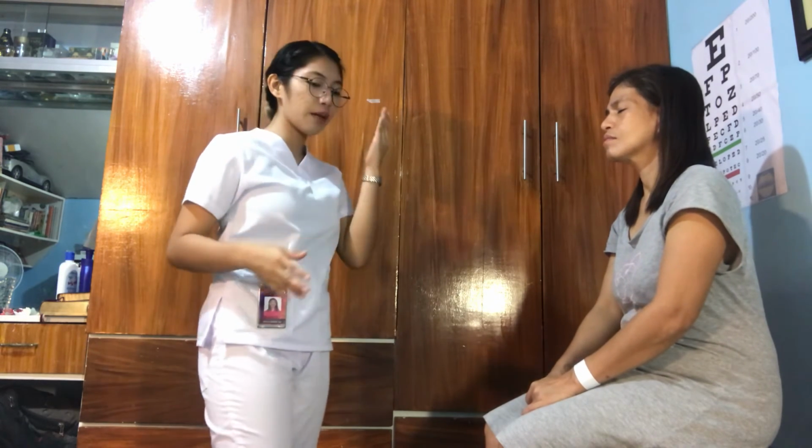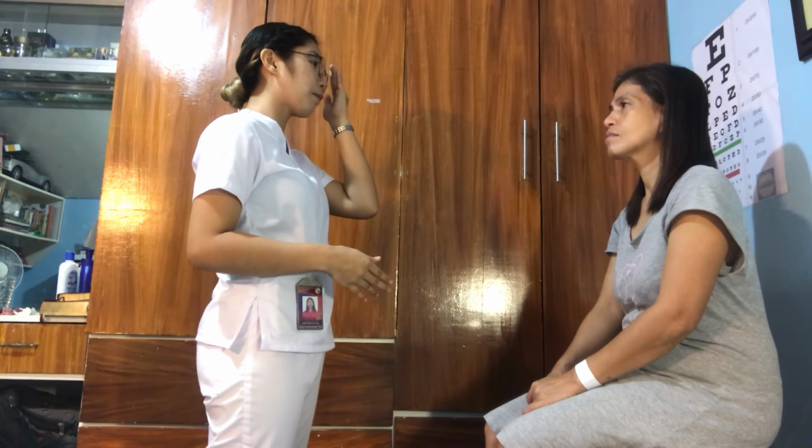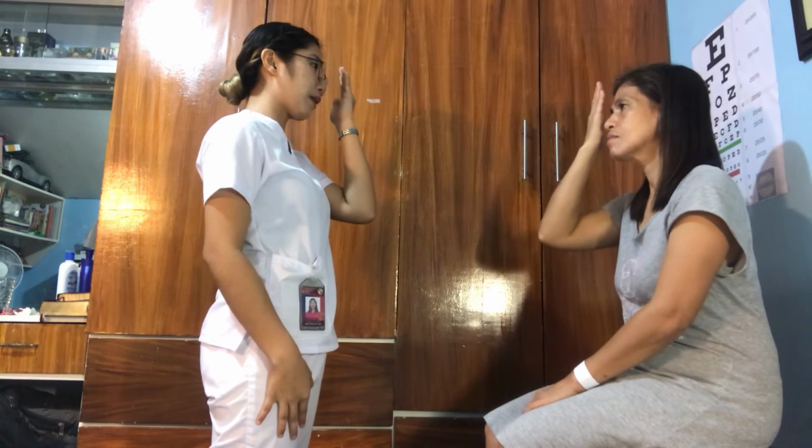So, Mrs. Tria, pikit po muna tayo. Okay, yung isang mata lang po natin, takpan po muna natin. Okay, open po ng mata. Itatakpan lang po natin ng isang kamay, yung isang mata. Okay. Okay, so as Mrs.